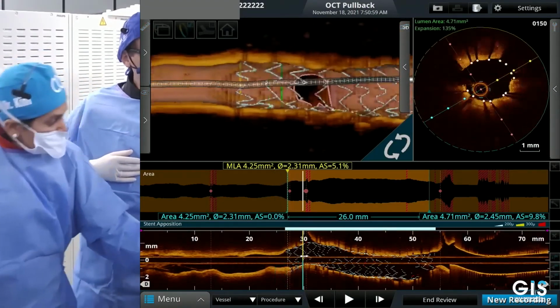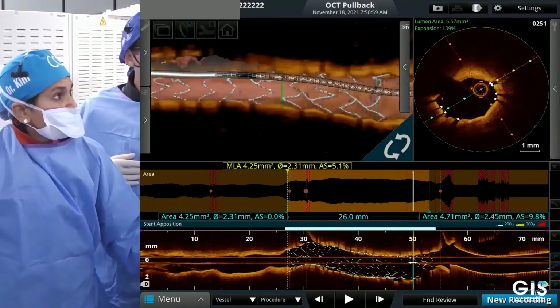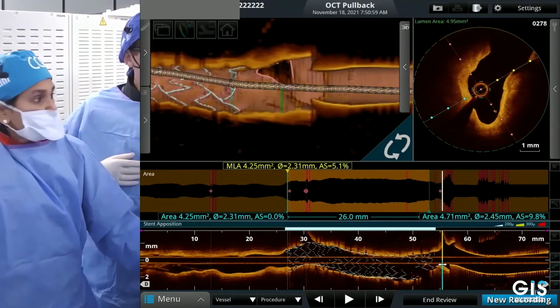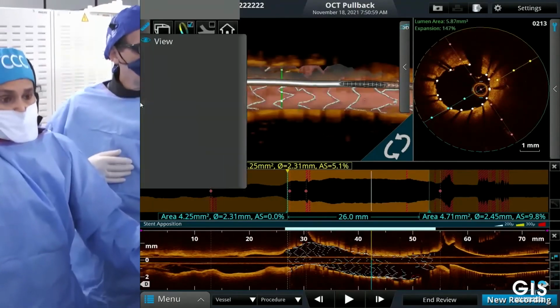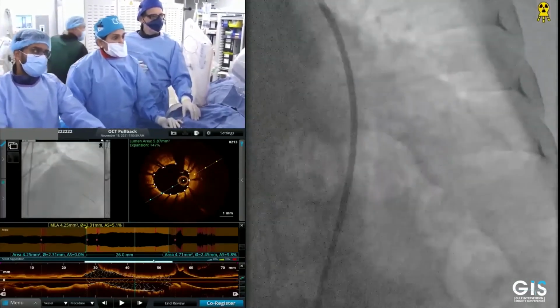So we have 4 minutes to go. Anything else, panelists? Dr. Mohammed Subhi. Anything else you want to do with imaging, or is it enough at this stage?